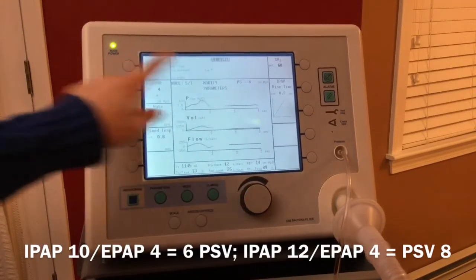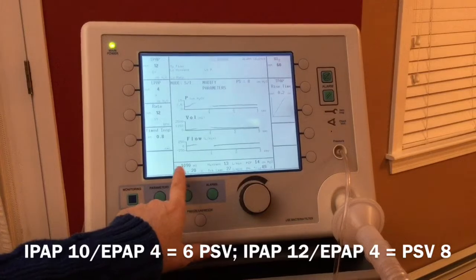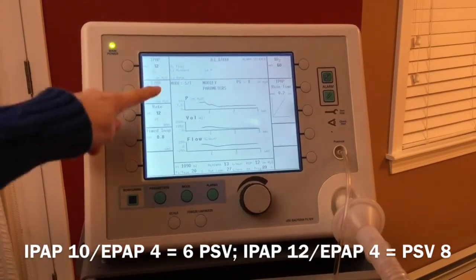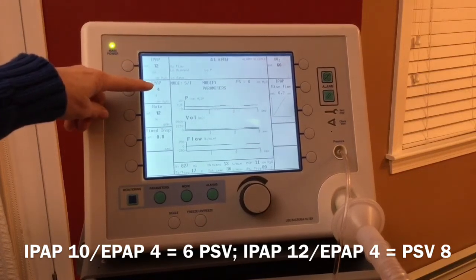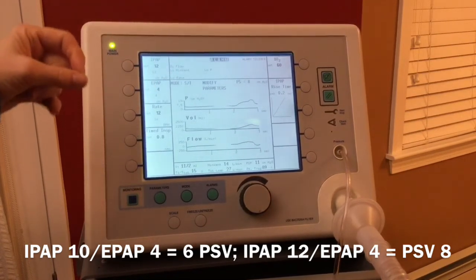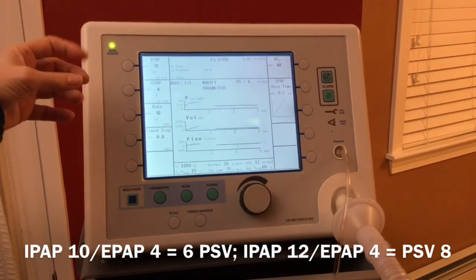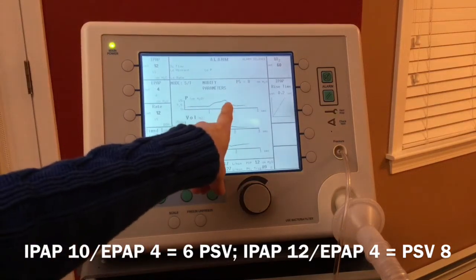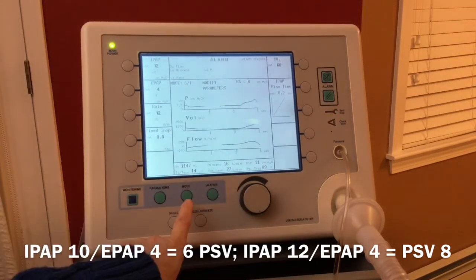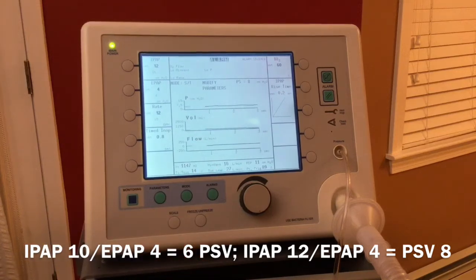you will see the patient's ventilation should increase. So their delta pressure change went from 6 to now a delta pressure change of 8. So that's like going from 6 of pressure support to 8 of pressure support. And you notice the scalar goes up higher where the pressure curve is. And look at our volumes here. We're at 1100 mLs per breath on the volume. So just moving by 2 on the IPAP has significantly increased our tidal volume size.